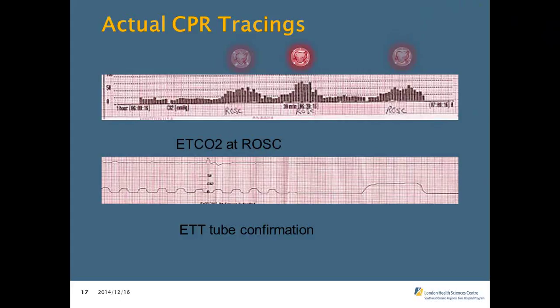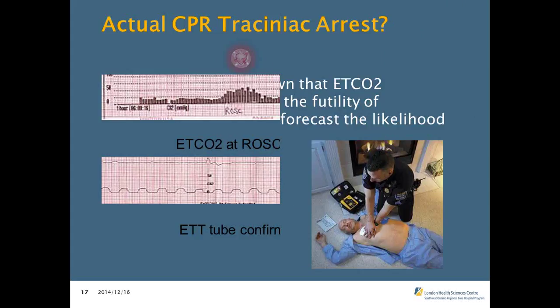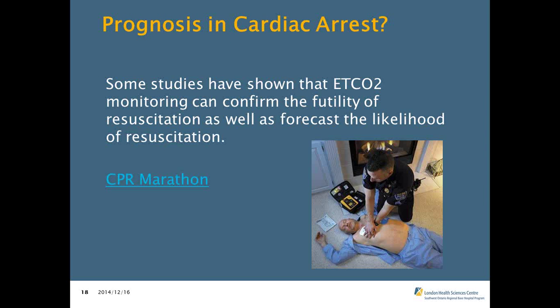Oftentimes, by the time EMS gets on scene, it's going to be a totally different picture when it comes to your EndTidal CO2 monitoring, despite the etiology of it. So don't use that alone to say, oh, this is purely a hypoxic arrest versus this is an MI arrest. While you're watching this webinar and listening to us, you're probably thinking, well, there's a lot of studies saying a lot of different things.